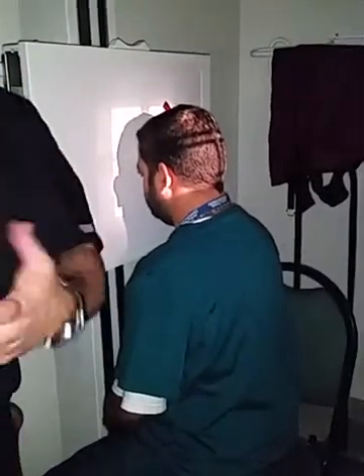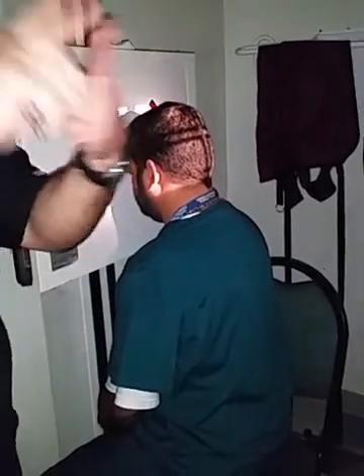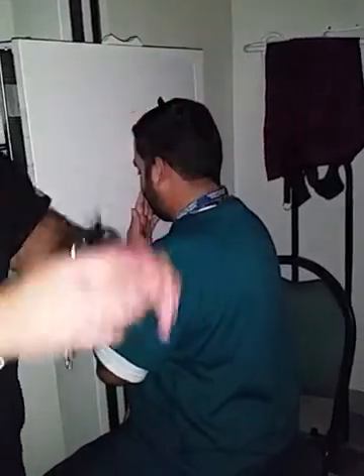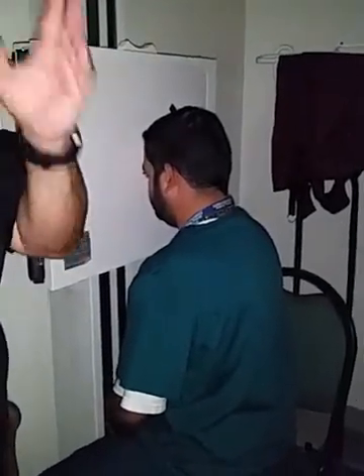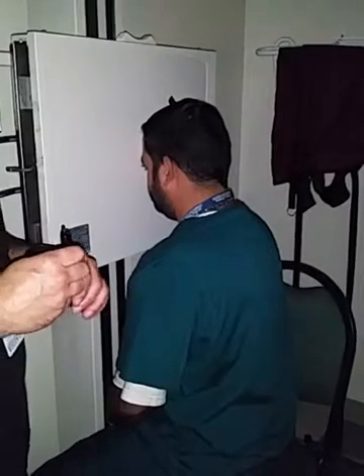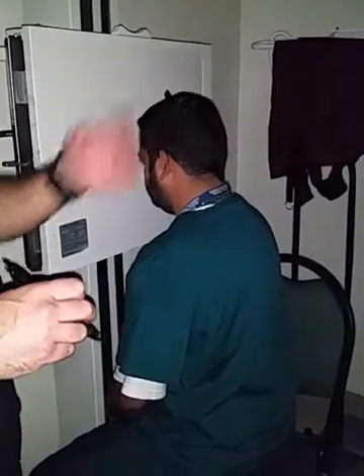As long as you mention that when you first come in and you do the whole questionnaire of what's your name, what's your date of birth and all that stuff. Tell them, hey, I need you to remove any earrings or necklaces. Do they only need just a little shield here, or do you give them the whole shield? No, you just use a waist shield. Waist shield's fine.